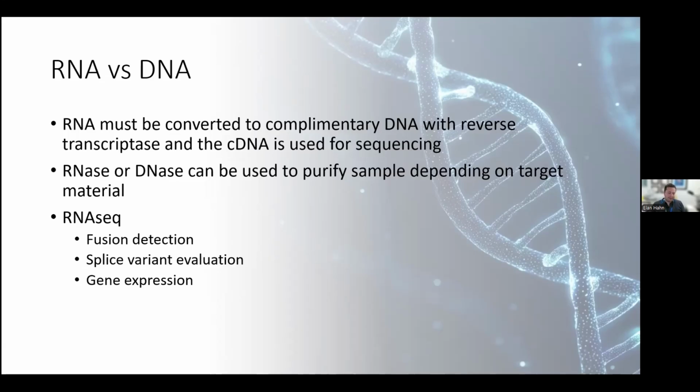So if you're just looking at DNA, you may not see an increase in the number of reads that have the fusion. But when you're looking at RNA, which is governed by expression changes, this may help selectively sequence fragments of RNA that have the fusion in it. So RNA-seq is definitely valuable and used most commonly for fusion detection.